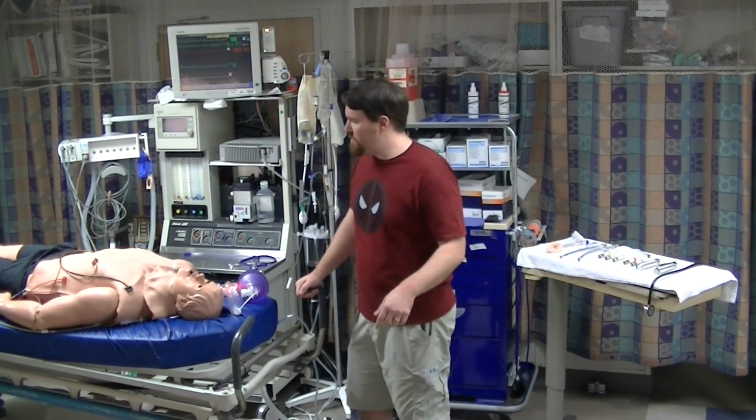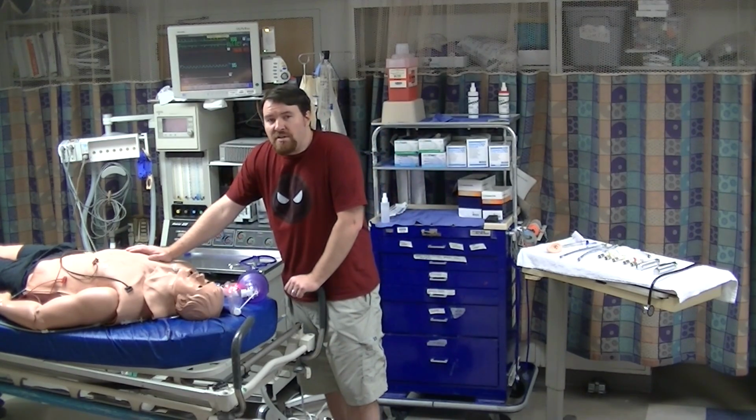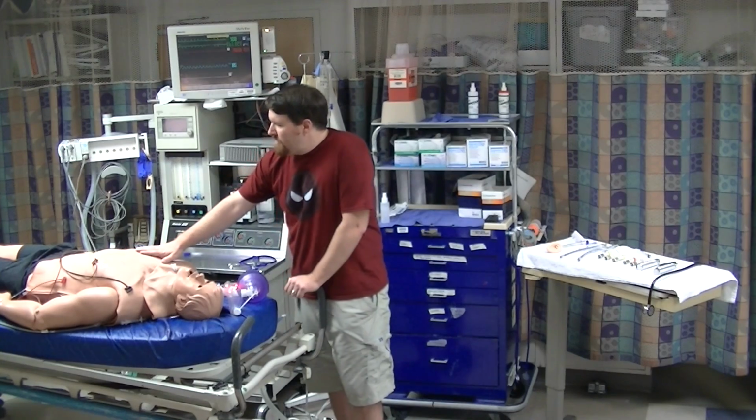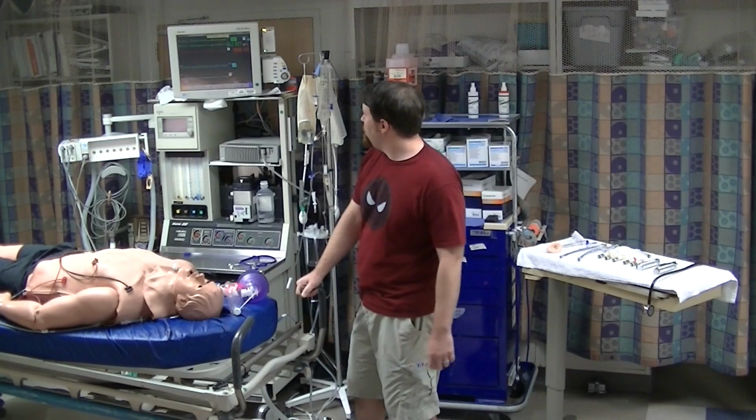Next thing is his breathing. We'd assess that with a stethoscope, see how his lungs sound. Then after that would be circulation. Circulation will go to the monitor form. We'll show you that here in a second.